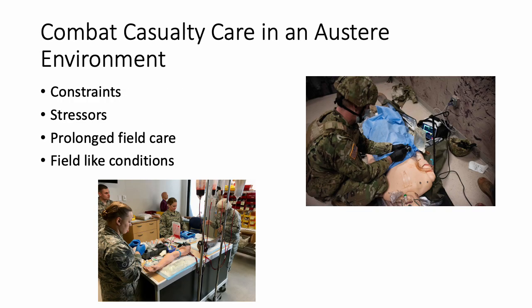Combat casualty care in an austere environment is very important as we relate using simulators to assist in training our military healthcare professionals to care for the warfighter in an austere environment. Simulators can replicate constrained resources like limited equipment and resupply and improvised care. Using virtual reality, we can add environmental stressors like increased noise, patient load, low visibility, constrained spaces, and overall increased amount of chaos to train on staying calm under pressure.